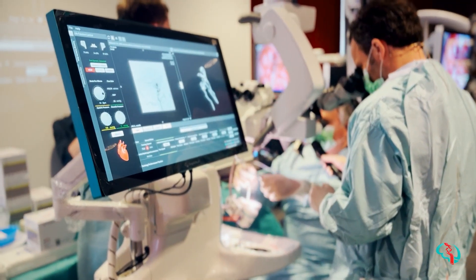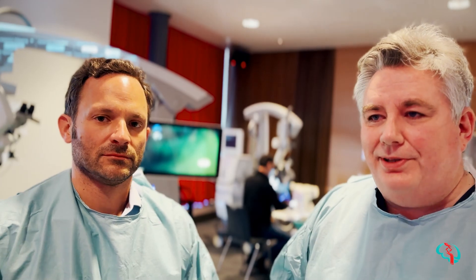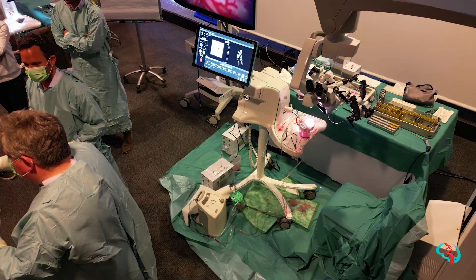What we were trying to simulate was an uncontrolled option — the situation whereby we've partially opened the sylvian fissure, but the aneurysm has bled. We don't have proximal control. We don't have access to the M1.